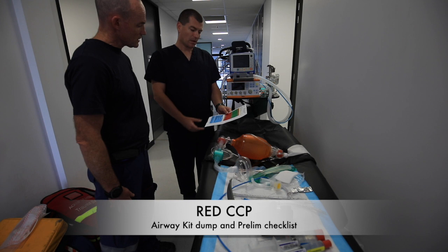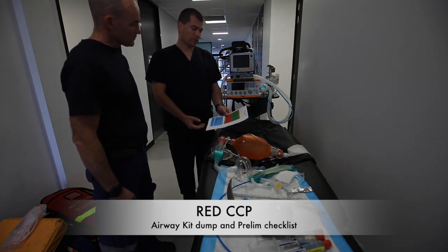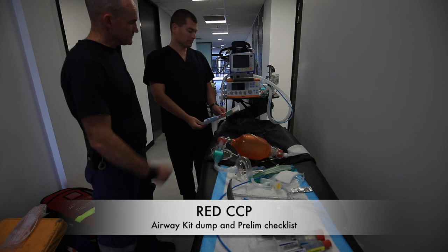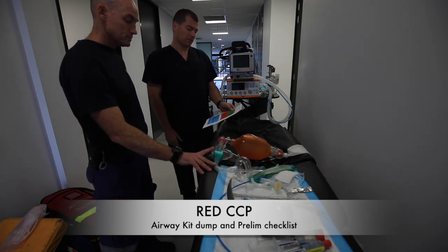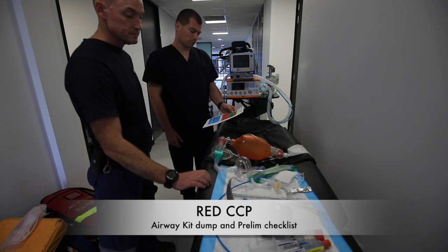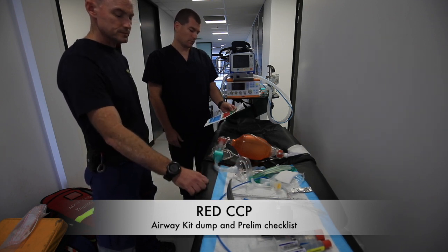PPE buddy check — we'll get to that in a sec. Orange role explained. Retrieval ventilator set up and checked. Circuit — catheter mount, HME filter, capnograph, push and twist — check. OPAs and NPAs — check. Laryngoscope — C-Mac light — checked.